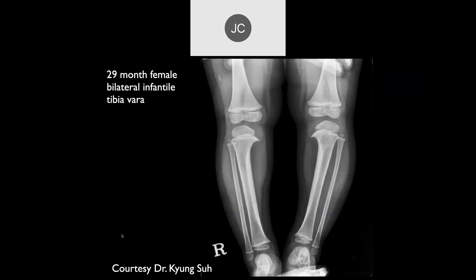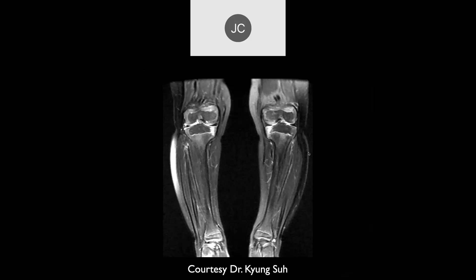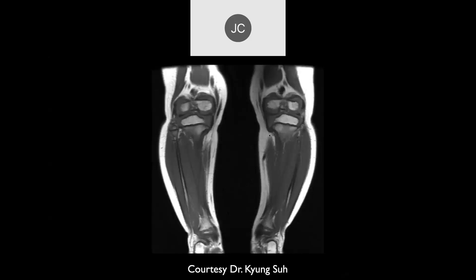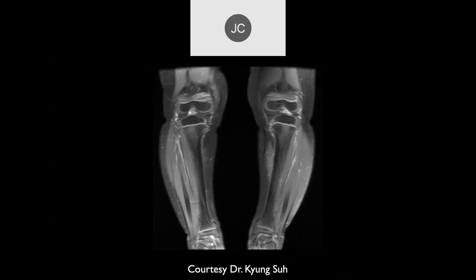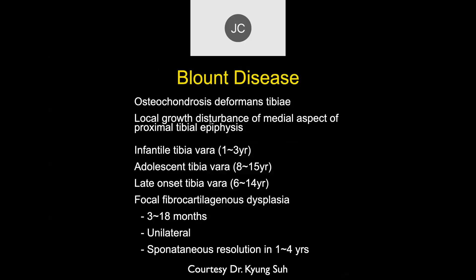In a 29-month-old female with bilateral infantile tibia vara, radiographs show prominence and peaking of the medial tibial plateaus symmetrically. On MR, increased signal extends through the growth plate into the metaphysis with hypertrophic bone formation causing beaking on both sides — cartilage extending into the metaphysis. This is Blount's disease, also called osteochondrosis deformans tibiae, thought to be a local disturbance in the epiphysis.